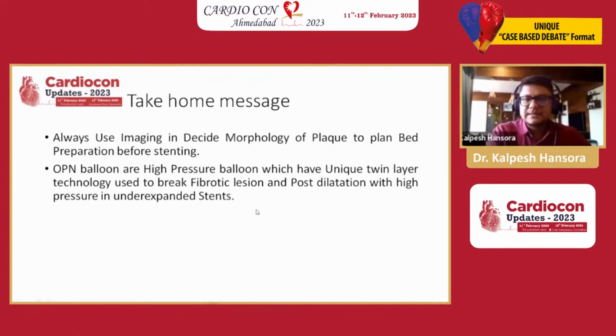And the OPN balloon, we know that it's a high pressure balloon and a unique technology. The twin layer technology is used to break fibrotic lesions, and it is also useful for post dilatation in an under expanded stent to prevent further stent malapposition and stent restenosis in future.